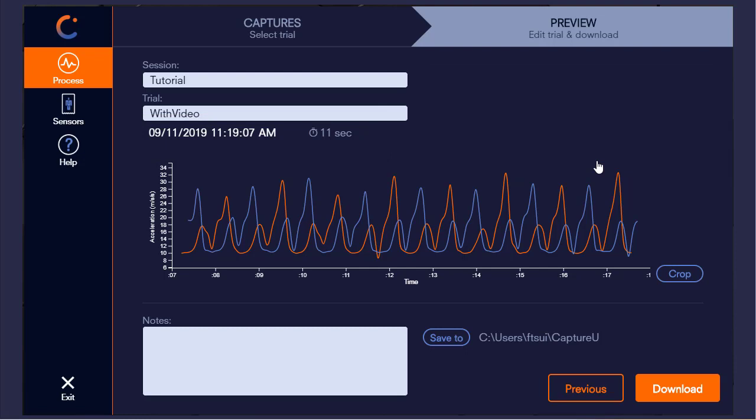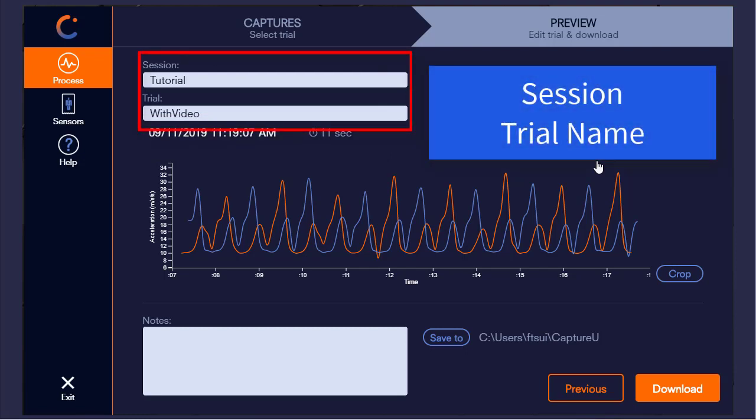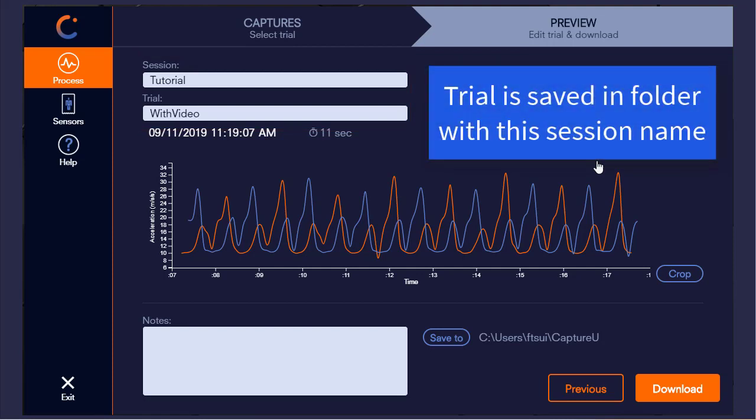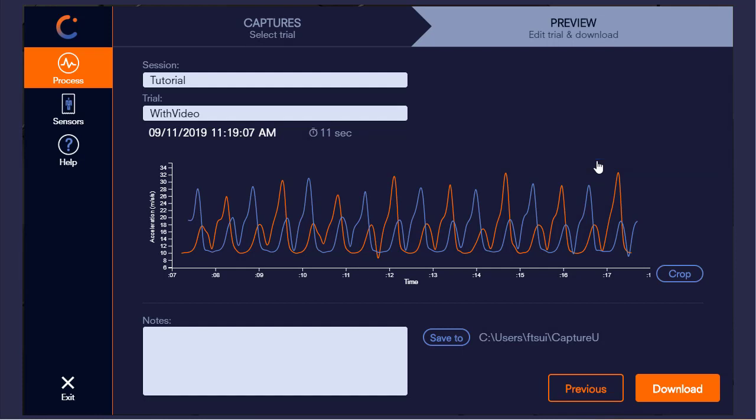Above this, we see the session and trial name which was specified within the app. When downloading, the trial is saved in the new folder with the session name, so you can edit these fields if you wish to have a different folder hierarchy or file name.